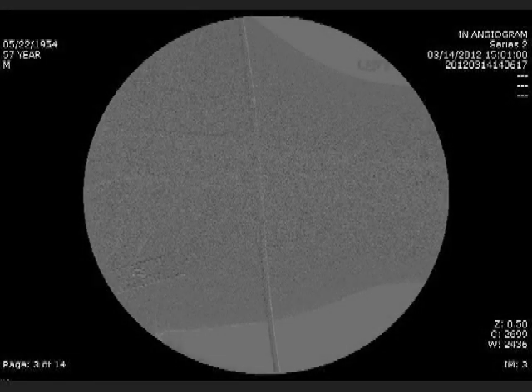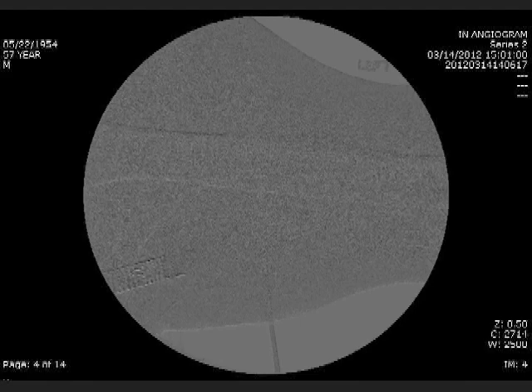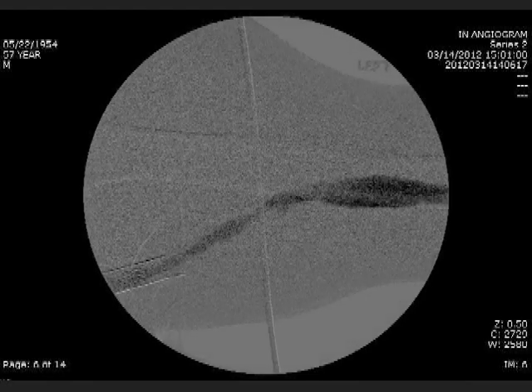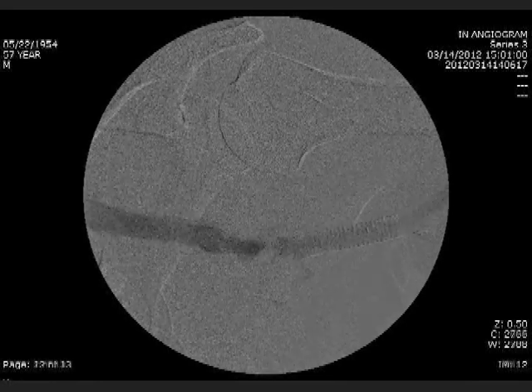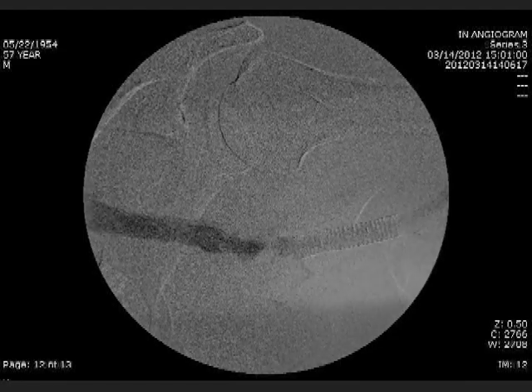The second case is a patient of mine I performed an angiogram on for high venous pressures. During the angiogram, you can see that he has a significant stenosis at mid-fistula and a significant stenosis at the distal end of his existing stent. In addition, there is a very severe 90% stenosis at the proximal end of the existing stent. These lesions were treated with a 10 mm by 4 cm non-compliant Conquest angioplasty balloon.